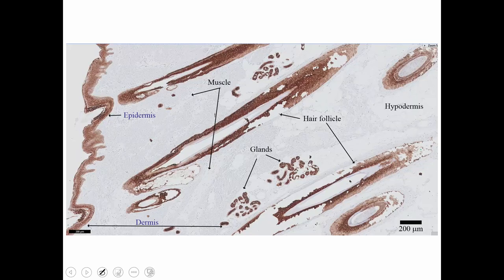Here you go, these are all sections. This is using keratin. This was prepared in the pathology lab in the hospital here, so we're not using anything that's not in the pathology labs. You can appreciate that skin is highly keratinized, with an excessive amount of intermediate filament protein in the cell, as well as the hair follicle sheath, as well as glands. Didn't I say glands are an extension of epithelial tissue? There you go, so the glands and ducts are staining as well. What's not staining are the connective tissues or the muscle that's here.